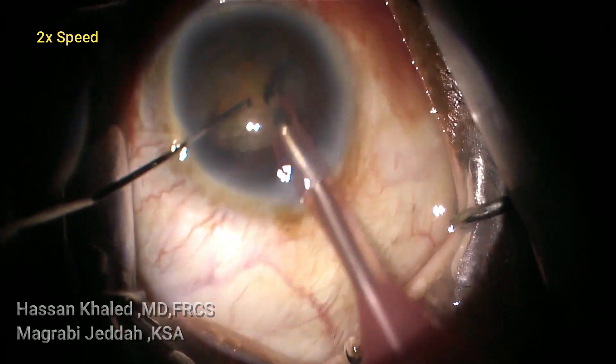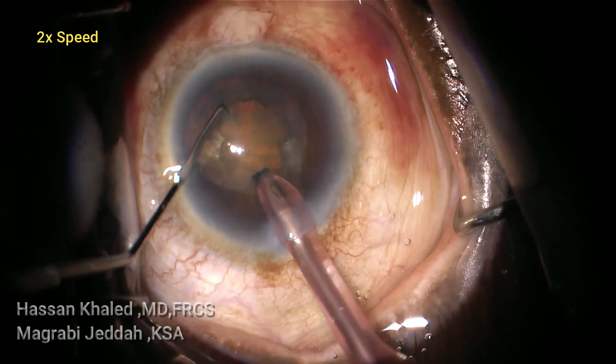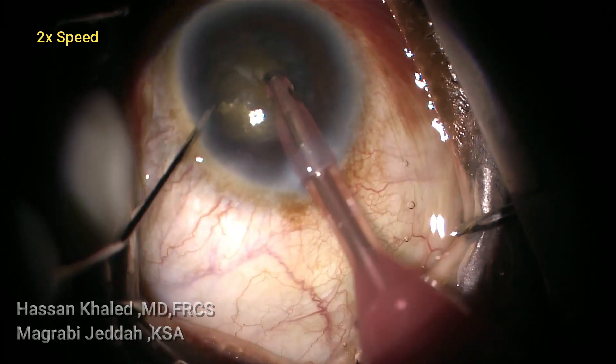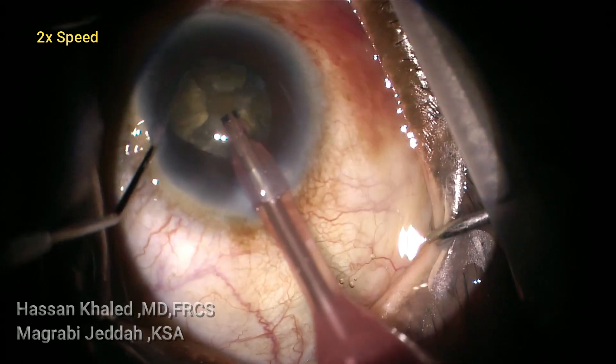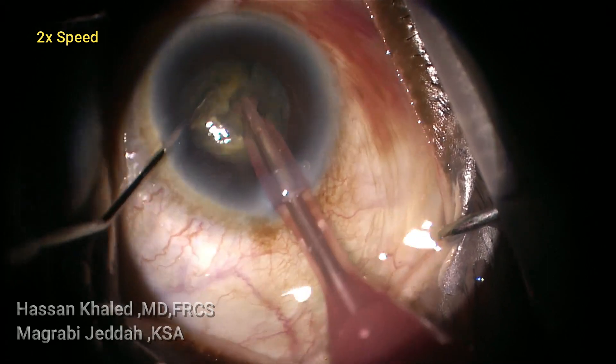Shaving the cortex, then you can see impaling the phaco tip in the hard nucleus, then doing vertical chop with a horizontal element. You can see chopping the nucleus into smaller pieces.